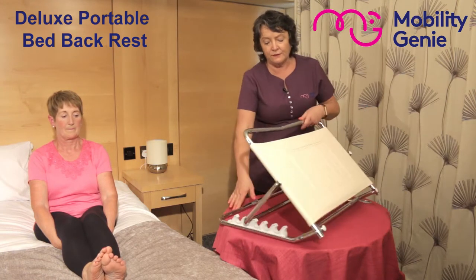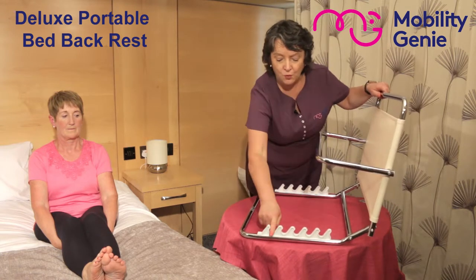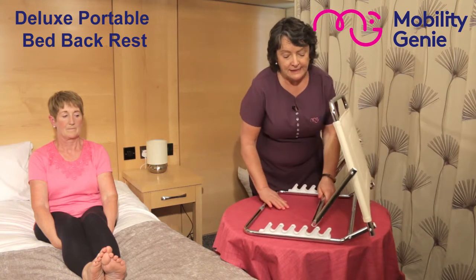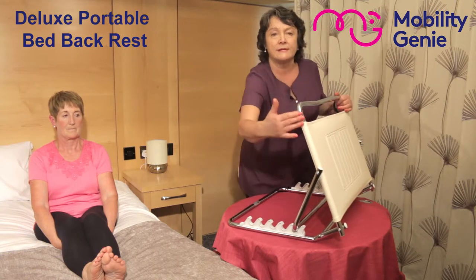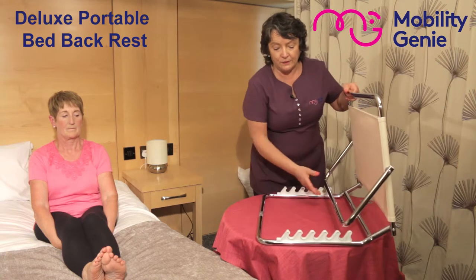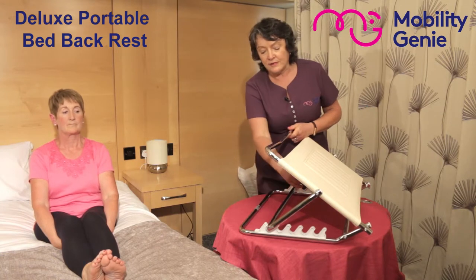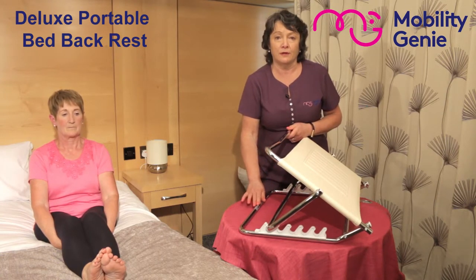It's adjustable to five different positions. At the first position, you can see by the angle that it actually puts a person into an upright position. And in the very last one, it allows the person to sit in a reclined position. All of the positions in between can be set to whatever comfort level is suitable for the patient.